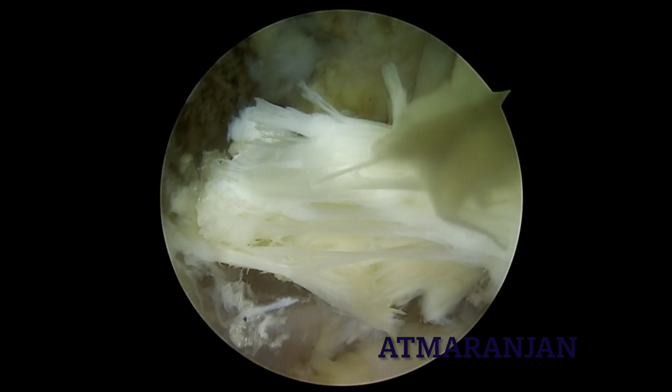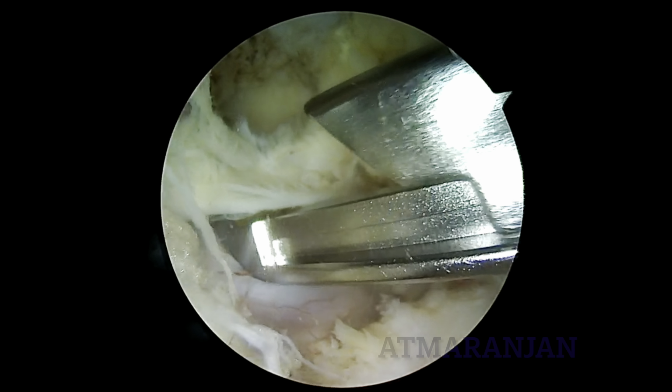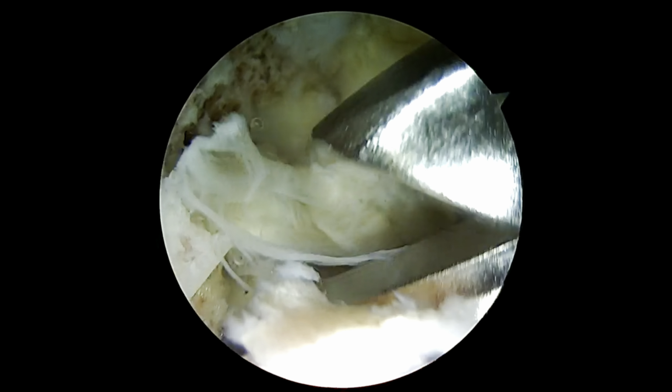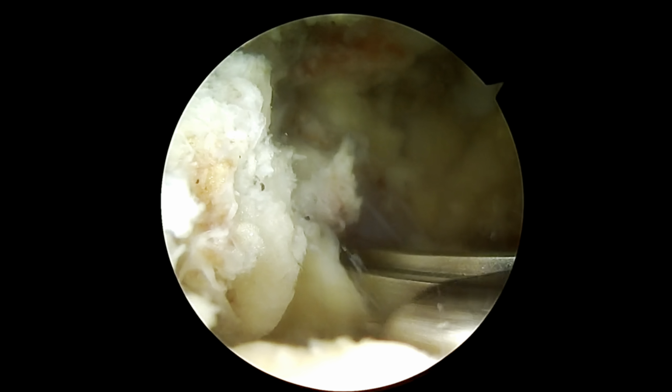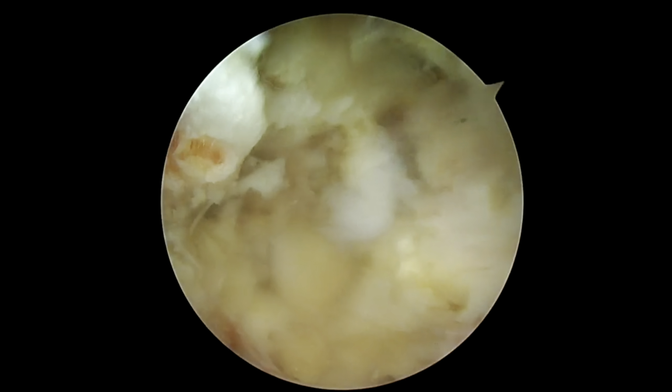So this is the 4-5 level. We are removing the ligamentum flavum slowly because in very severe canal stenosis the ligamentum flavum is somewhere attached to the dura and dura is very thinned out, so you have to carefully remove the ligamentum flavum. I have also done the decompression from same ports and extended it to the L5-S1 level.